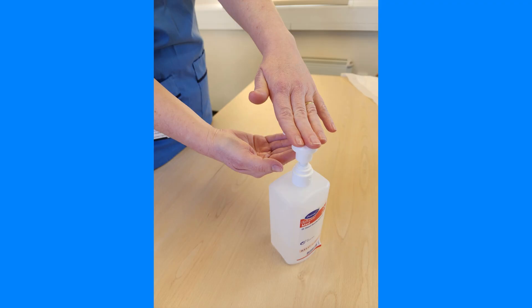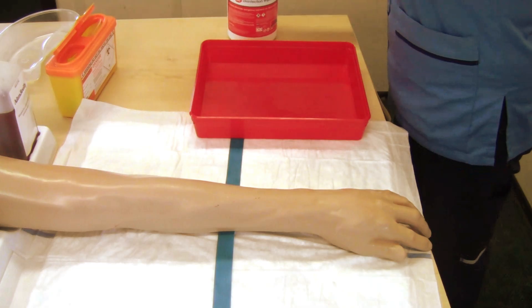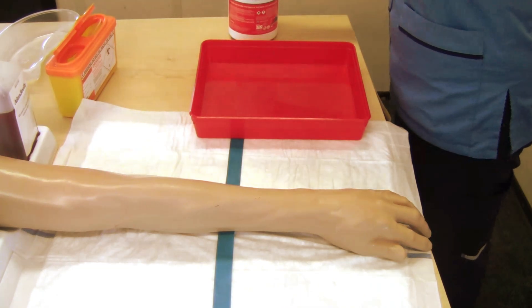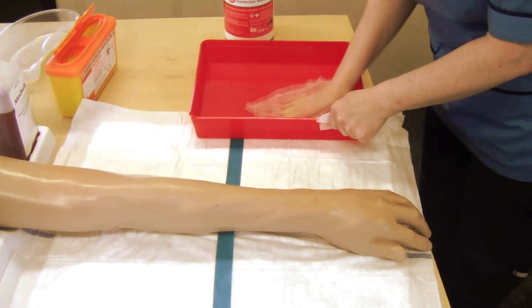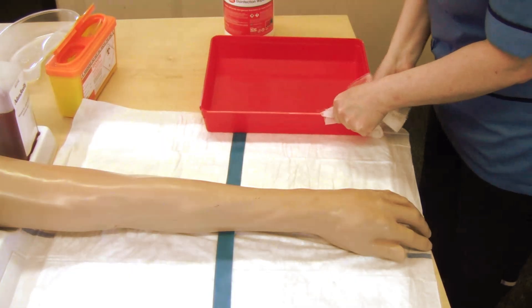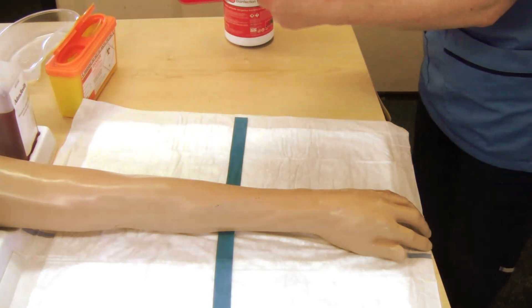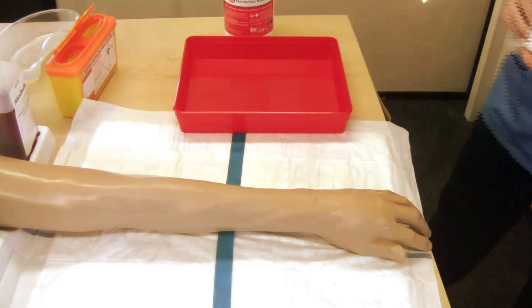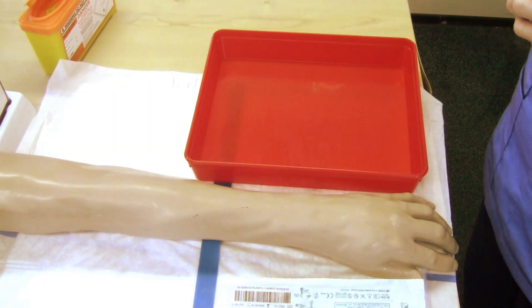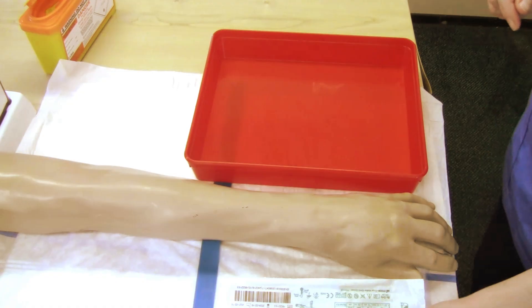Perform hand hygiene. Disinfect your wipeable tray for ANTT — aseptic non-touch technique. Prepare equipment for cannulation and prime the extension set using ANTT, ensuring not to touch key parts.